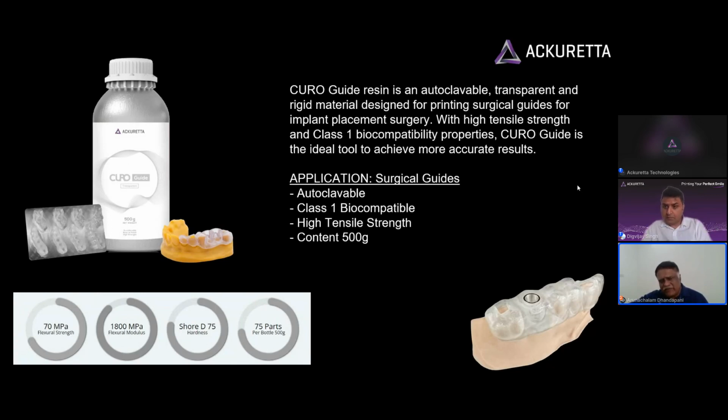Otherwise, you will have to improvise and come up with some idea to be able to position your implants appropriately and adequately. So all I'm trying to emphasize is that a guide is not going to replace a certain skill or clinical acumen that you develop, but at the same time, it's going to make your job a lot more convenient, easy, and faster in regular terms.